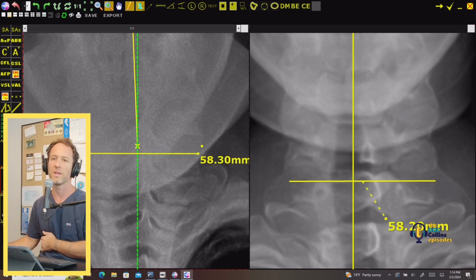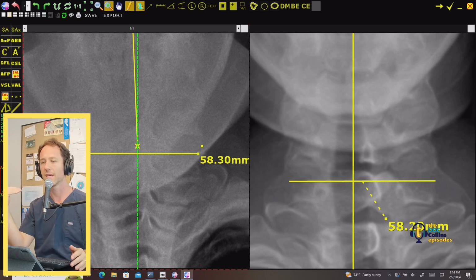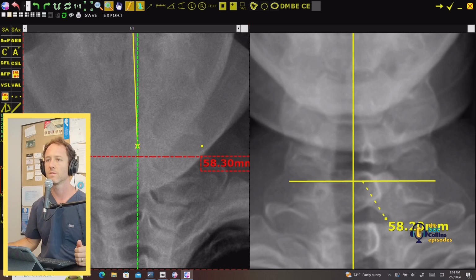And within advanced orthogonal, you have a protocol. When you get above 20, you know, with the combined Bucky angle and the height of the tube, you should be taking an additional view. It's an S2 at 10 is what we go by. But sometimes you're in the middle there, and you can still be kind of washed out down by the C7. So you have to do a little bit of troubleshooting so you're not overexposing everybody and just taking an S2 at 10.